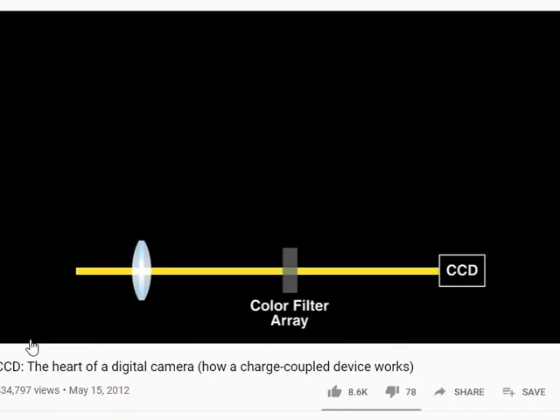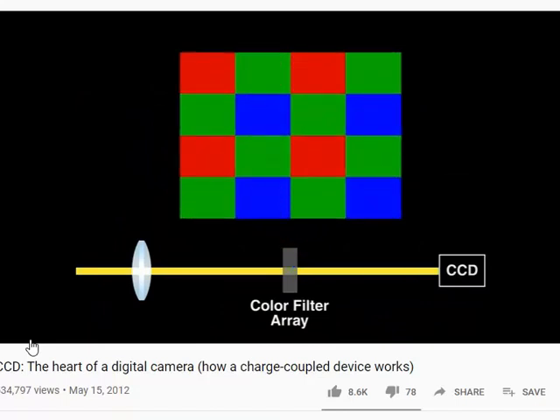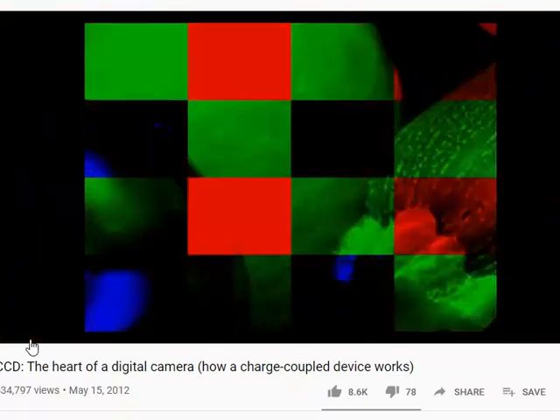In this consumer camera, they cover that single CCD with a filter with red, green, and blue pixel size sections. This creates an image coming out of the CCD that's a mosaic of these three colors. The camera applies an algorithm to estimate the correct colors for each pixel. For example, if a green filter covered a pixel, we would need to estimate the red and blue components of that pixel. To do this, they'd use the adjacent pixels and average the color intensity for the pixels in question.